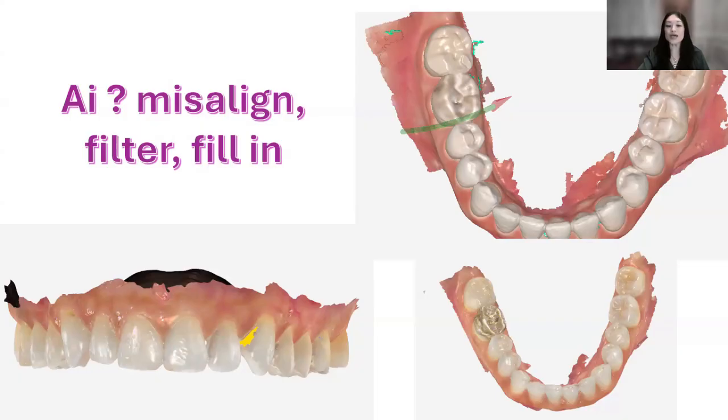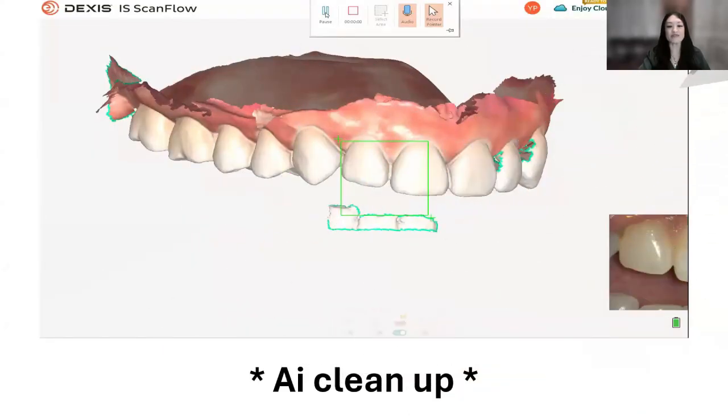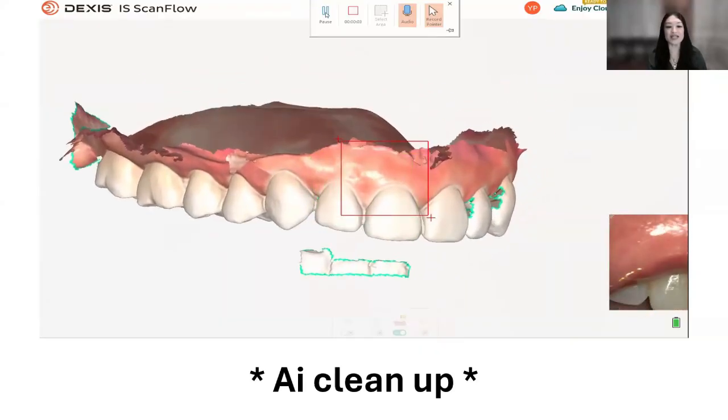With the scanner, you can go at the speed that you want. So if you go into those hard to reach areas where the tongue's in the way and you just need a little bit more help, slow it down. Get your bearings together, slow it down, get great data accurately. So understand that the scanner is going to go at the speed that you want. And there's times when we can go really, really fast, and there's times when we just need to slow down for accuracy. Let's go ahead and see it in action. As the video plays, you're going to watch that the AI is going to filter out the lip. It's not even going to collect the data.